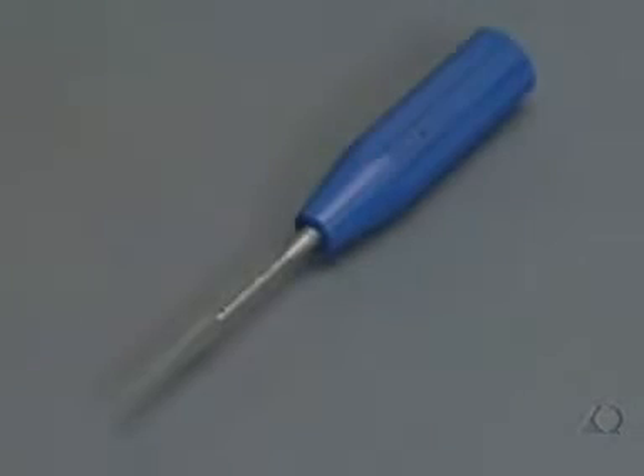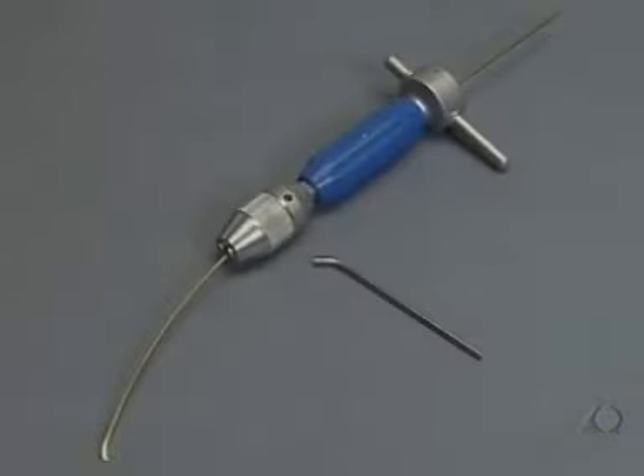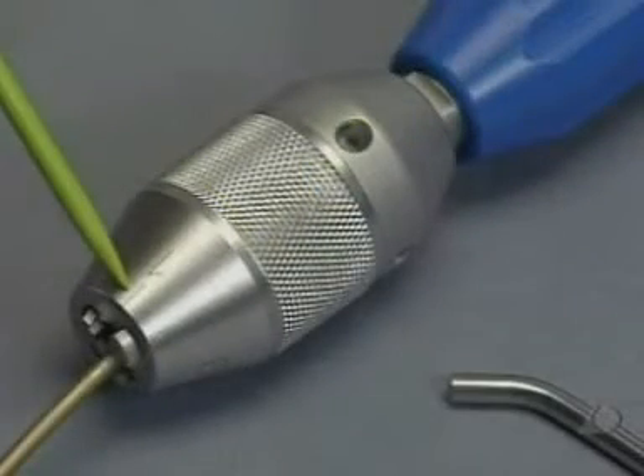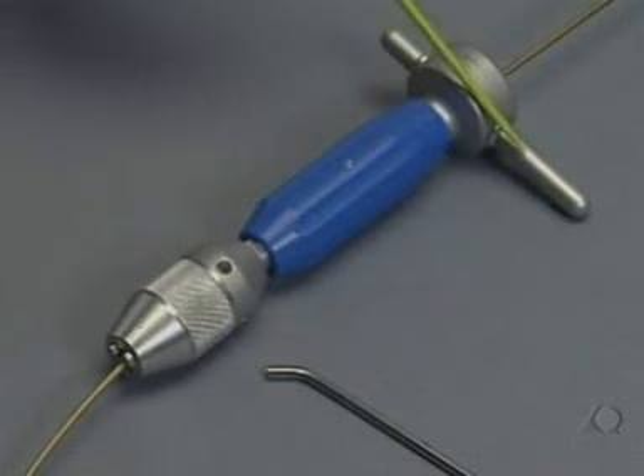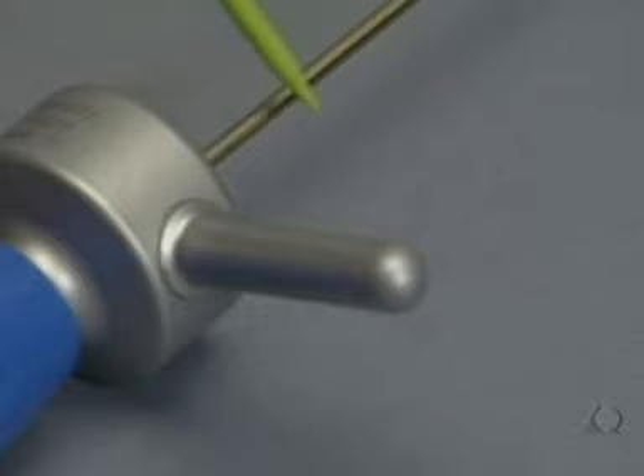An awl with a sharp tip, or the standard instruments consisting of the 2.7, 3.2, and 4.5 mm drill bits with the double drill guide, and an inserter with a pin wrench. The tip of the nail is aligned so that it comes to rest in the same axis as the asymmetrical T-piece. The additional markings on the chuck and the asymmetrical T-piece serve for orientation of the rotation of the nail. Hammer blows on the T-piece must be avoided.